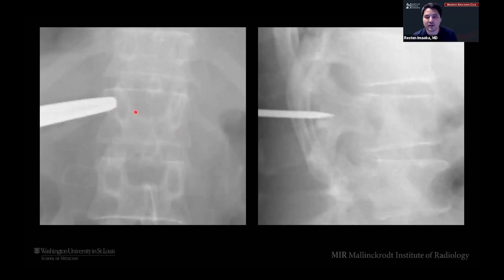We'll confirm as we put our needle in, as we're going in, to make sure we're straight in the middle of the pedicle, right? The ideal goal is to get right in the middle of the vertebral body so that you're ablating as much of the entire vertebral body as possible, right? We kind of approach this the same way a rad onc would approach it, which is to treat the entire vertebral body, even though the MRI may show that there's only a small lesion on the right side. There's always some micro disease that you cannot really see that well or cannot appreciate on the MRI. So we always try to treat it as much as possible and do the entire thing.